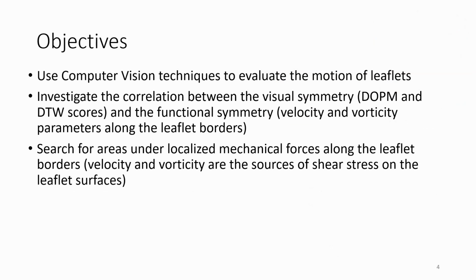In this study, we take advantage of this available visual data and use computer vision techniques to evaluate the motion of leaflets. This allows us to investigate the correlation between the visual symmetry and the functional symmetry, in other words, the velocity and vorticity parameters, and to search for areas under localized mechanical forces along the leaflet borders.